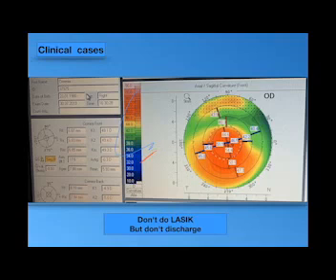Okay, I'm with you. Again, I agree with you. The intracorneal rings are used always to correct or to regularize the irregular cornea, but it is not classic irregularity in this cornea because the topographic corneal astigmatism is insignificant.